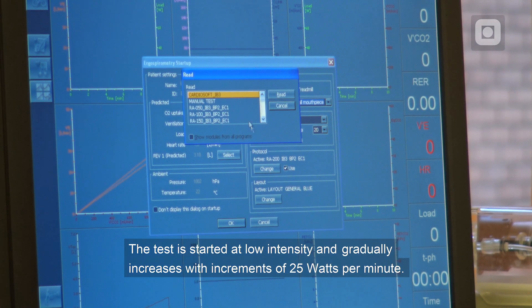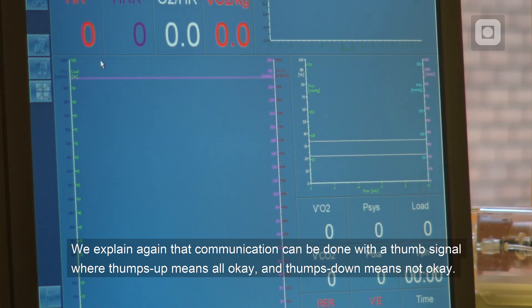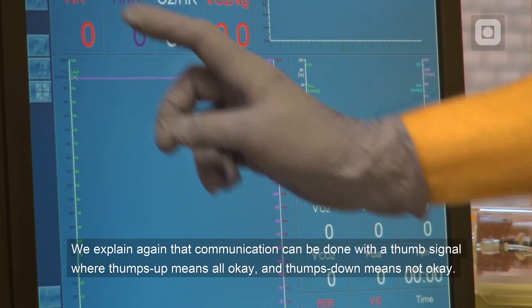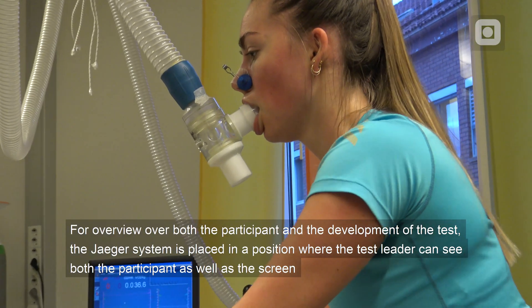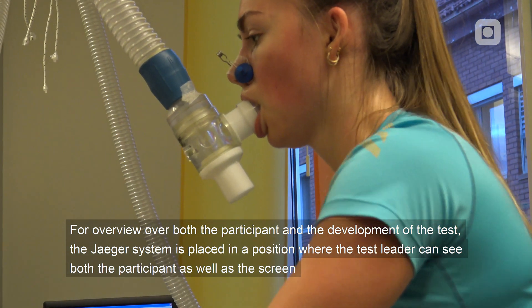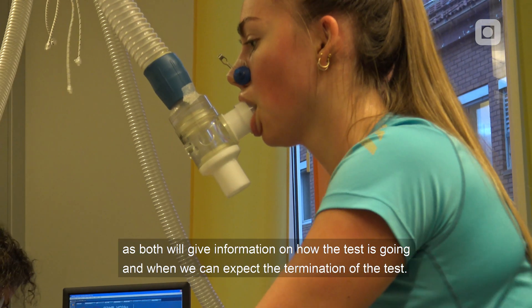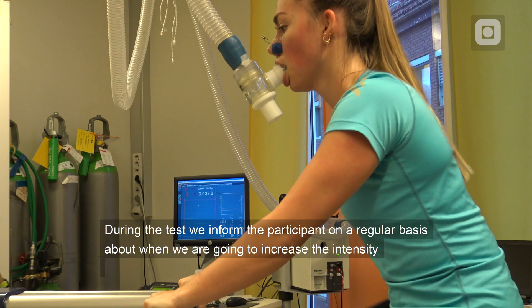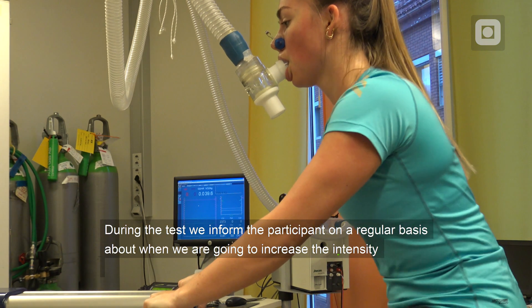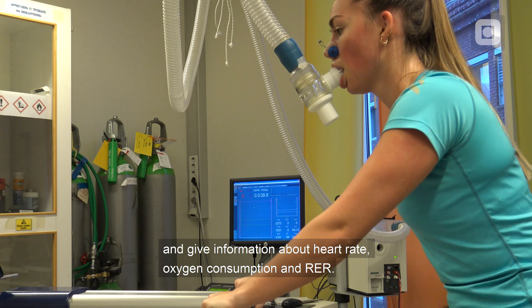The test is started at low intensity and gradually increases with increments of 25 watts per minute. We explain again that communication can be done with a thumbs signal: thumbs up means all okay, thumbs down means not okay, and it is then the task of the test leader to figure out what is going on. For overview over both the participant and the development of the test, the Jäger system is placed where the test leader can see both the participant and the screen. During the test, we inform the participants regularly about when we are going to increase the intensity and give information about heart rate, oxygen consumption and RER.